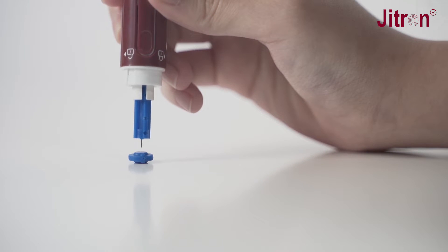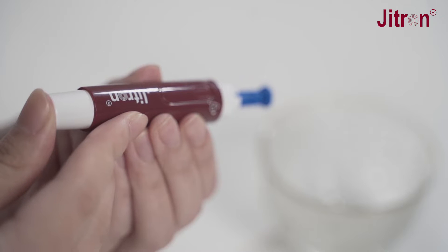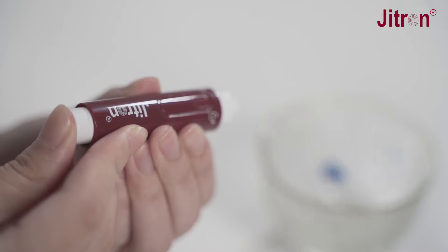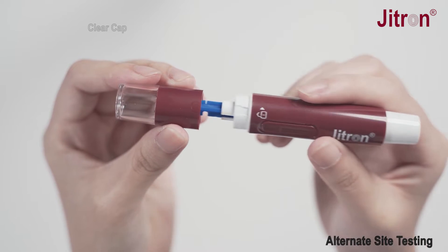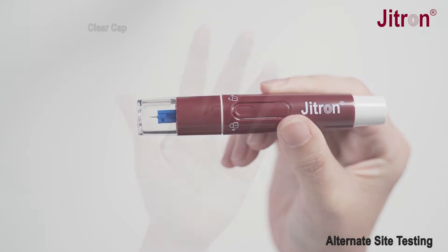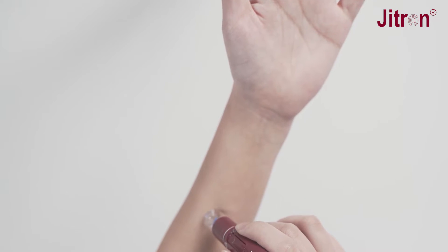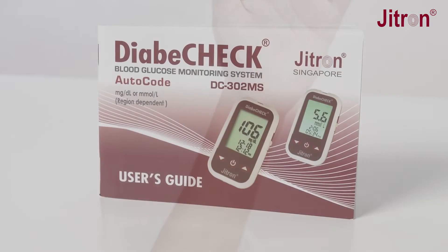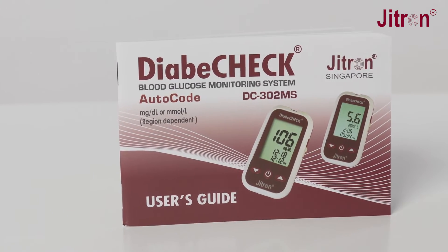Push the exposed tip into the protective cover and eject the used lancet carefully from the lancing device. Use the clear cap of the lancing device to get blood from alternate sites. Please refer to the user's guide for testing on the palm and the forearm.